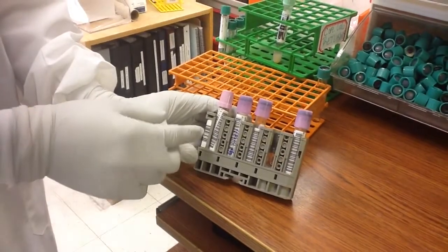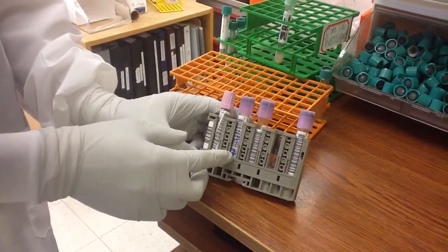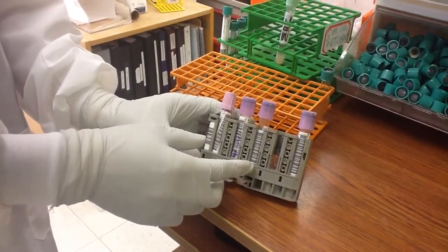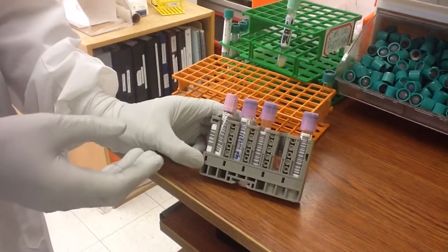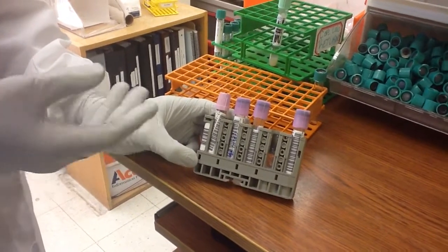So if there is a twisted label, writing on the label, or if the label is placed too low, there's going to be a barcode error and the instrument is not going to know what to run on which patient and which tube.